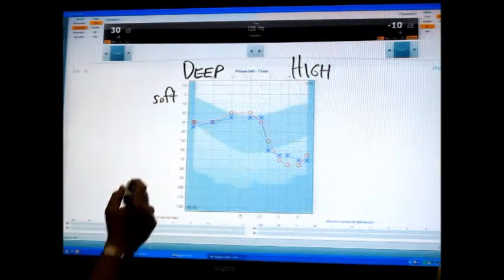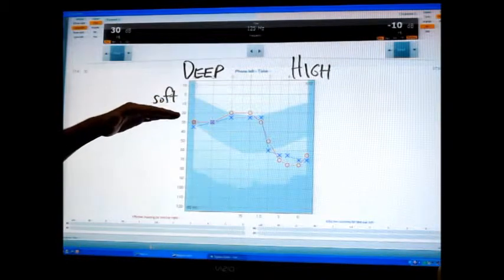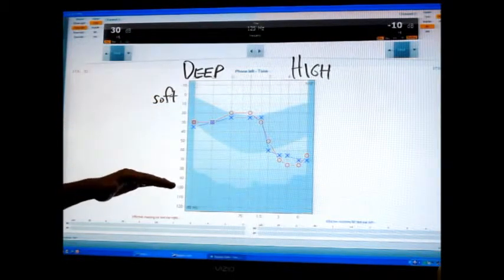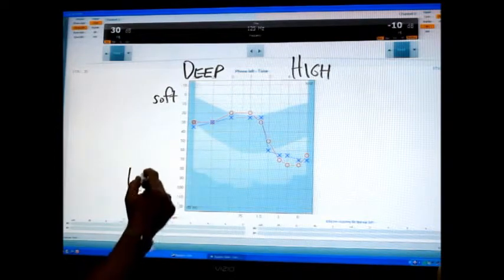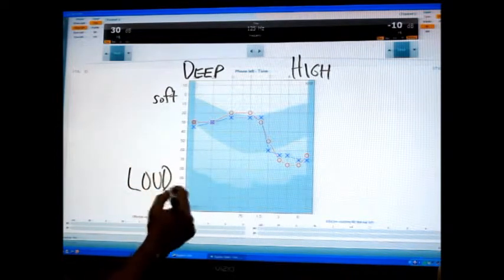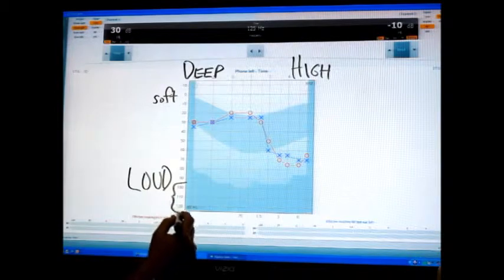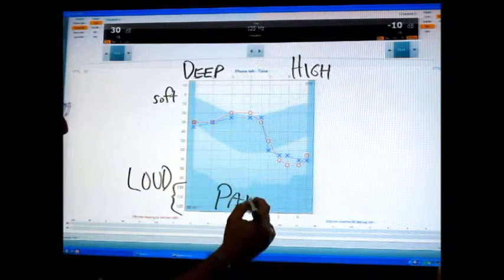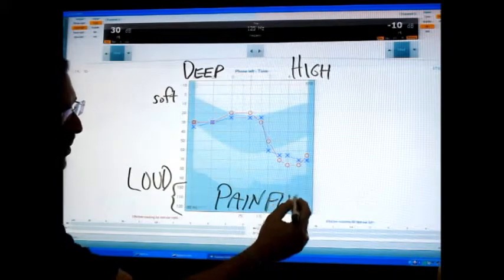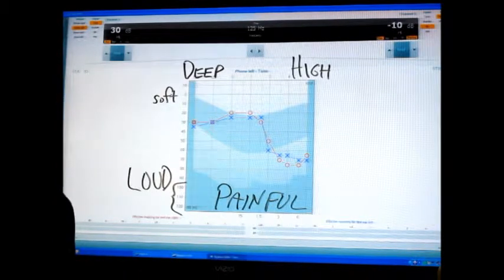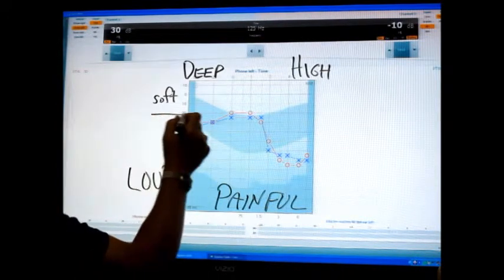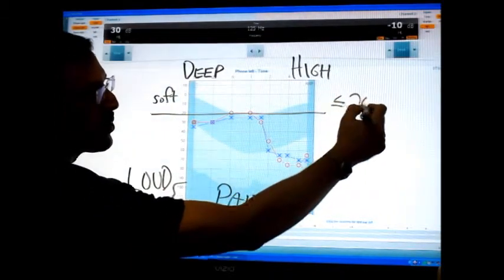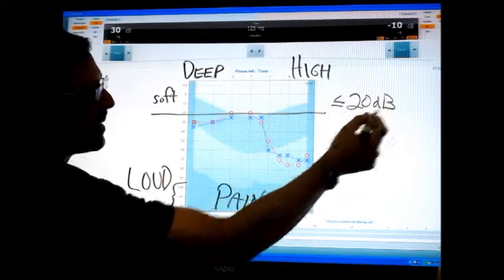At the very top of the page we have soft volume, and the volume measured in decibels is getting louder as we go down the page. When we get down here to the bottom of the page around 100 to 120 decibels, this is usually painfully loud for most people with normal hearing.